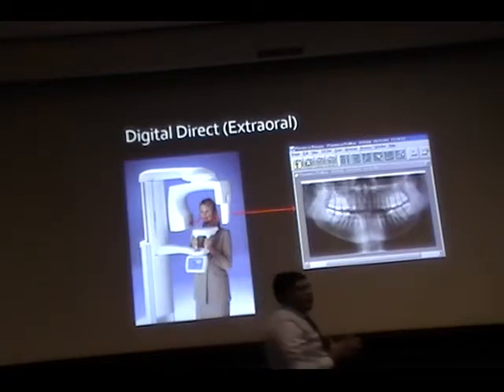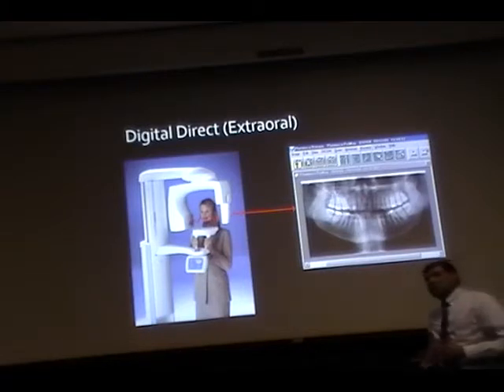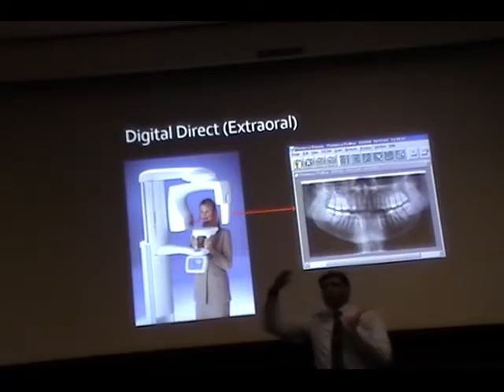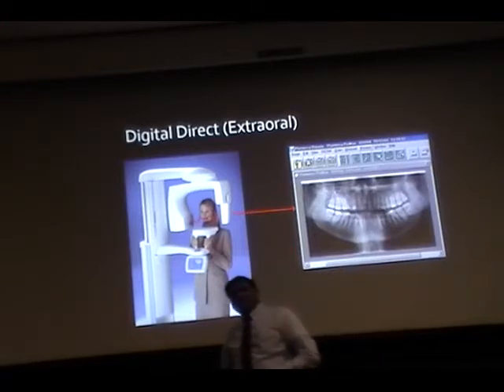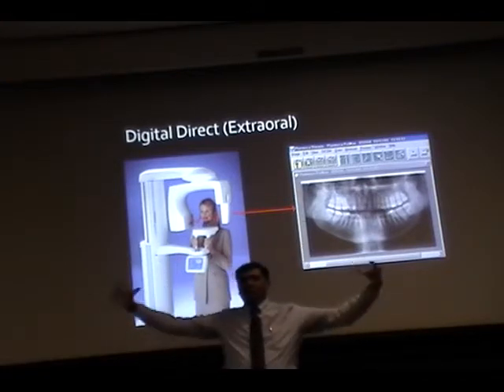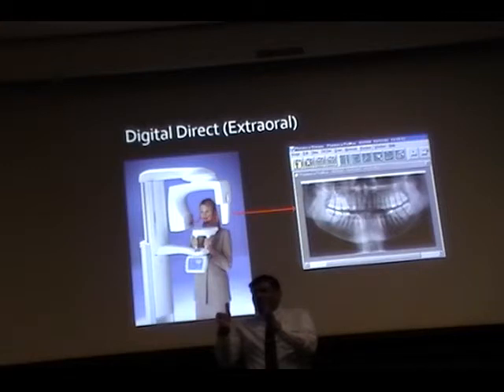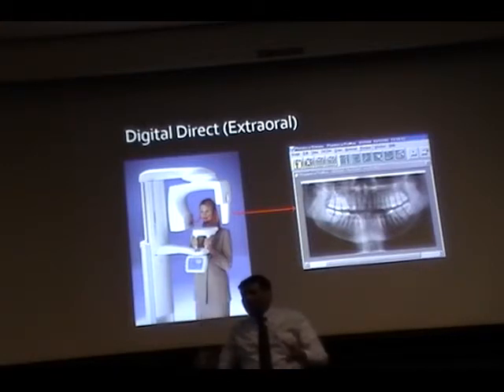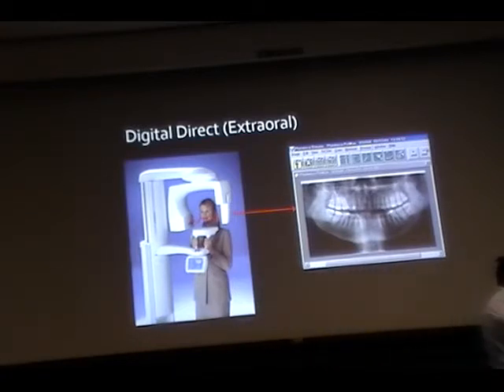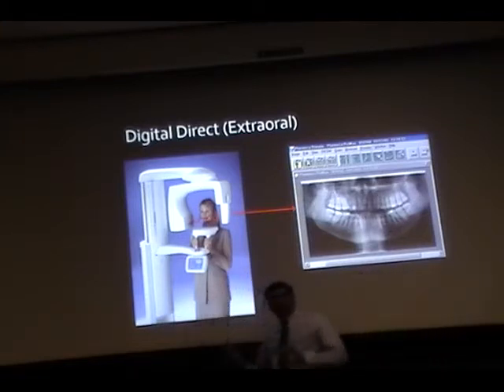If you are going to buy a machine with an image intensifier, an example would be the Sirona machine. It's huge, it's bulky. One example, if you go to the Craniofacial Imaging Center upstairs, it has a C-arm that's huge. The footprint is very, very long. We have dental offices like this, right? If you put in a huge machine, it's not going to work for us. So the footprint is larger for image intensifiers, and the flat panel is sleek and easier to install.